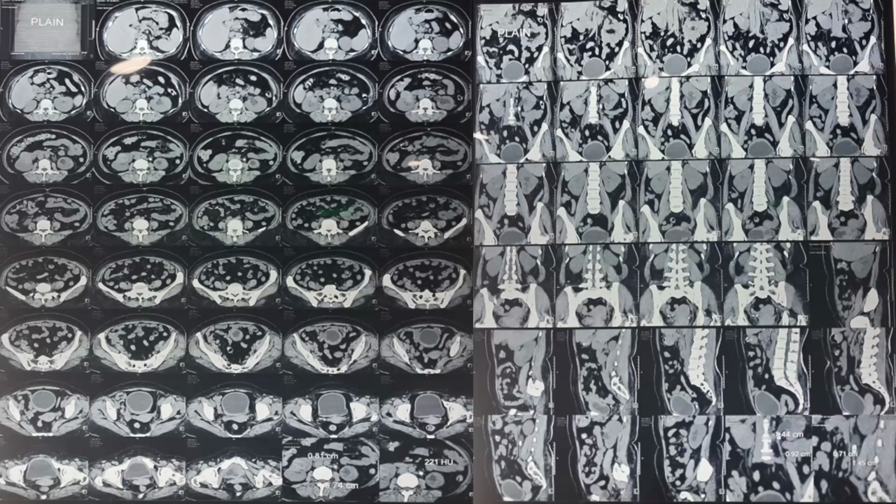Brijesh, you have got other films? No, sir, this was not done at our institute. Actually, the patient had done it from outside and had come. So now you understood what is important in this case, that everything is not delineated properly. All the information is not given to you.